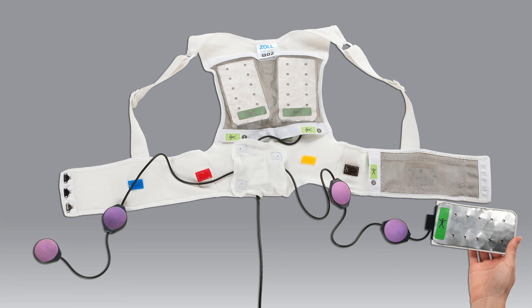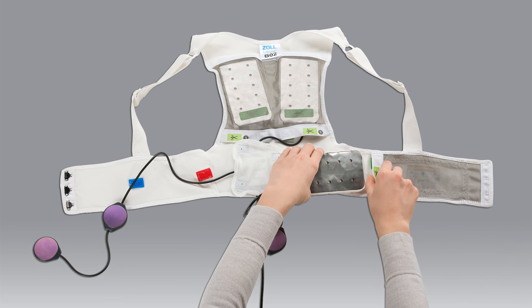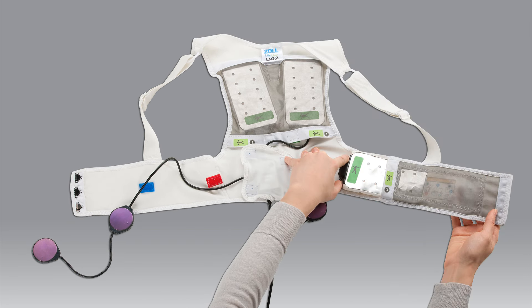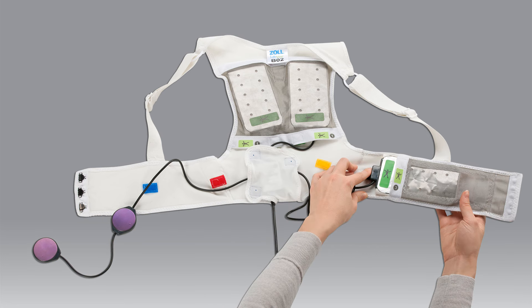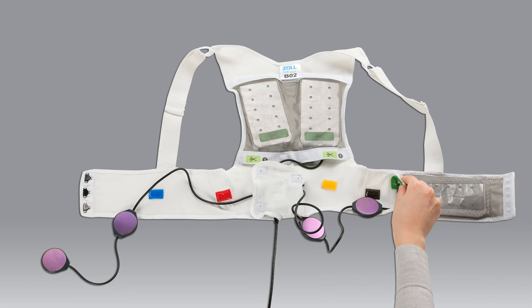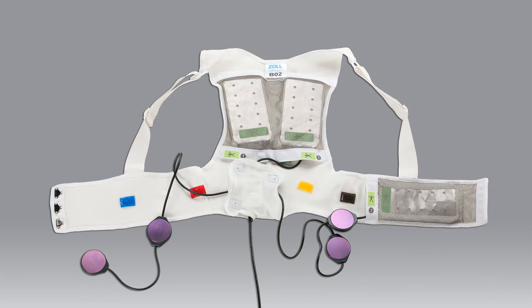When you have secured the vibration box in place, insert the single therapy pad into the front pocket. The front pocket is numbered 3. Once again, make sure that the silver side of the pad with the green sticker is facing the silver fabric on the pocket. When the therapy pad is fully inserted, snap the pocket closed.